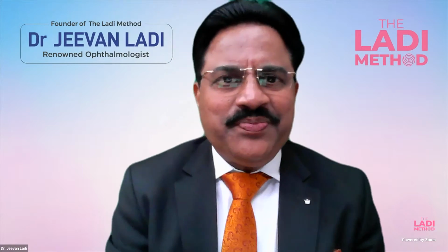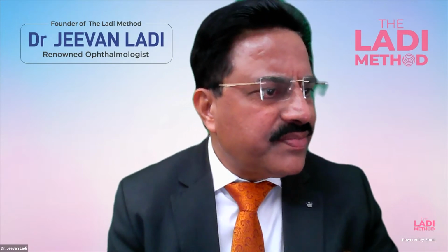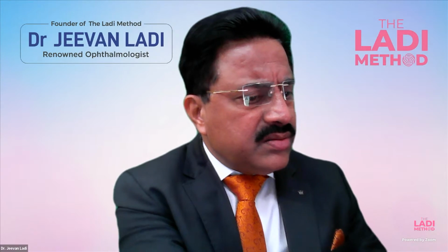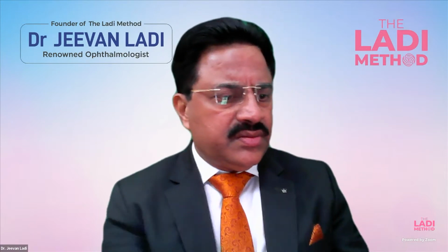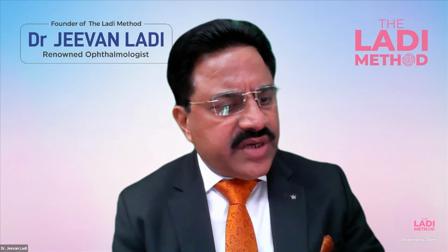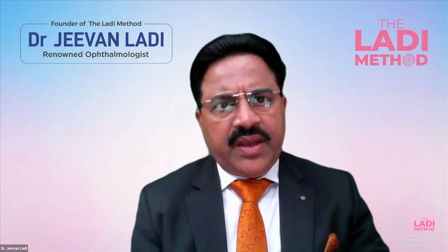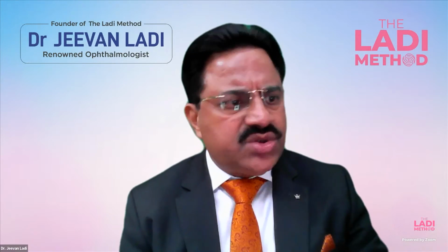I think we are through with most of the questions. Is there any? Okay. There's a question from Dr. Albert, and he's asking for tips to calculate IOL power in high myopia and high hyperopia. I think both the methods are comparable. Immersion and optical biometry, both are good. And swept source optical biometry is doing an excellent job.